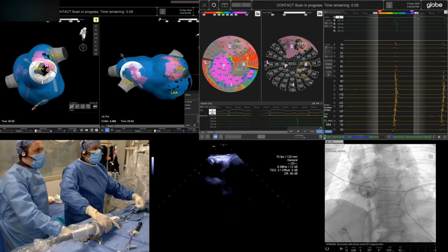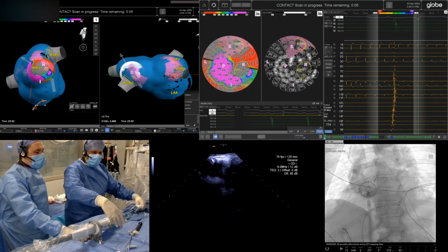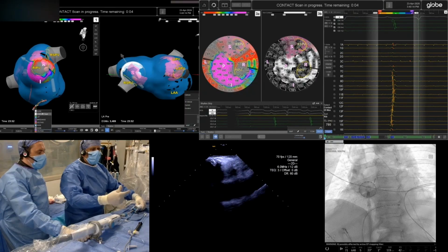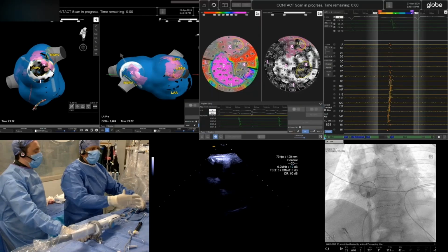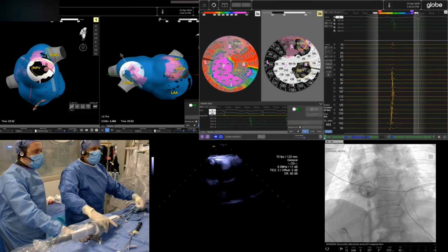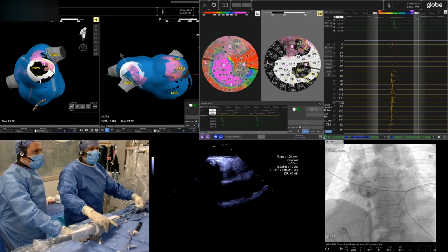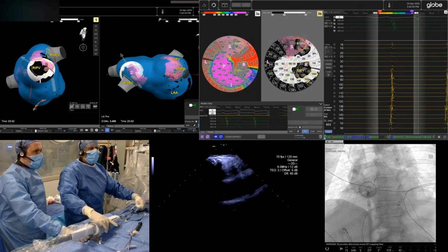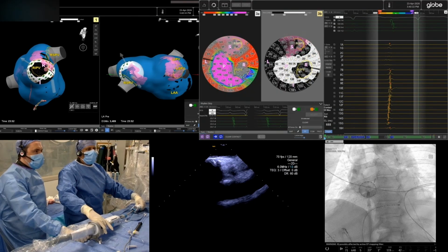No, you rotate. During the lesions, we don't deflate. It's always this one configuration. We use the sheath quite a bit to get into the veins we want. Overall, it's not too bad to maneuver. It just takes a little getting used to. We just went from the right superior to the right inferior right now.